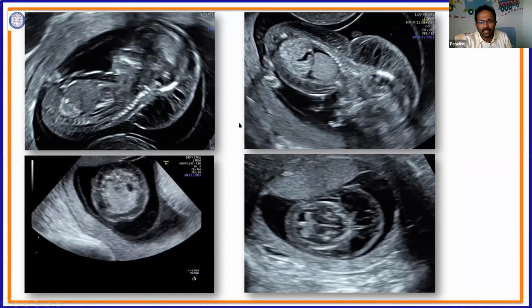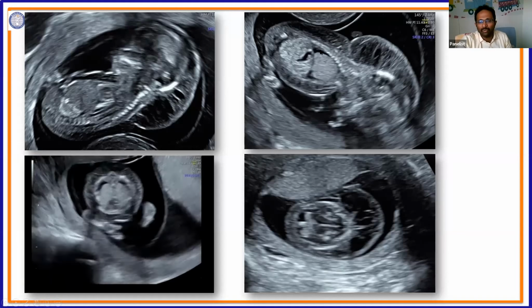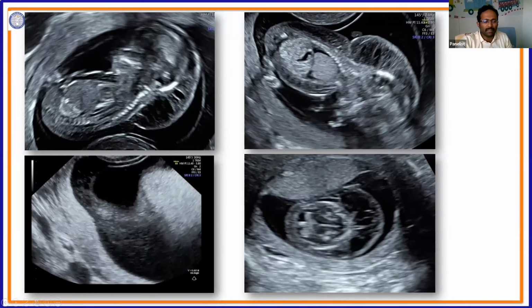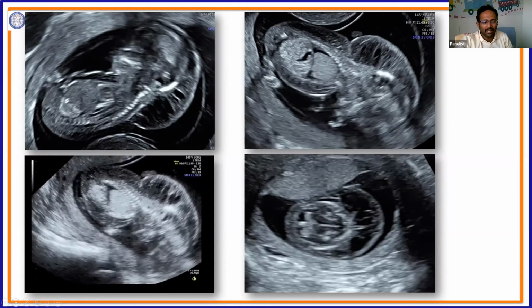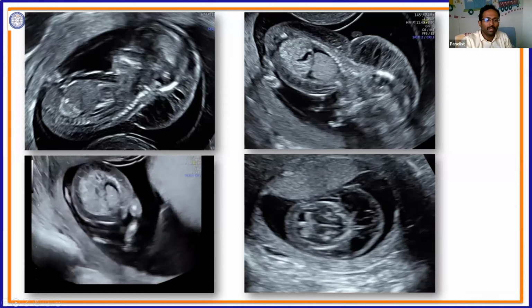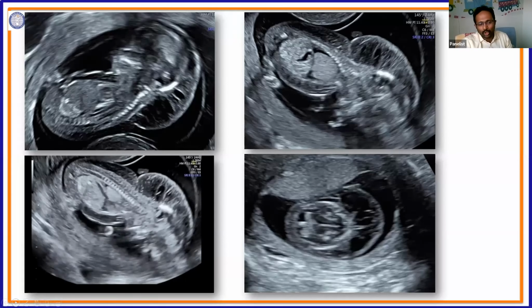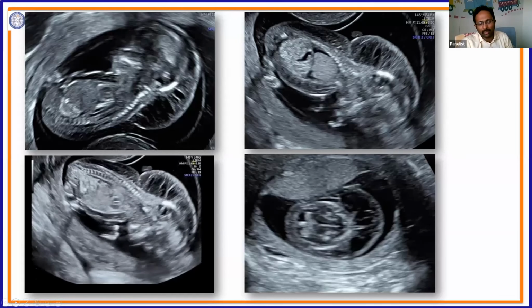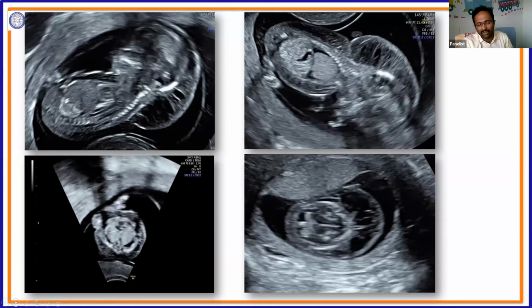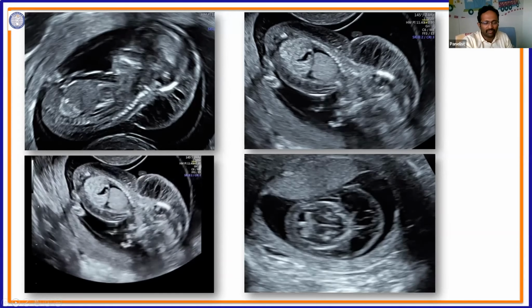And this baby incidentally also has edema around the baby fully. There's a fluid collection around the lung and the abdomen. And hence, as you can see, this baby has a condition called hydrops. And hydrops has a 50 to 60% association with chromosomal problems. So a large septated cystic collection, cystic hygroma, most common cause chromosomal, second common genetic syndrome. So you need to offer genetic testing by a karyotype, and beyond that, if it is normal, prognosis is not favorable.